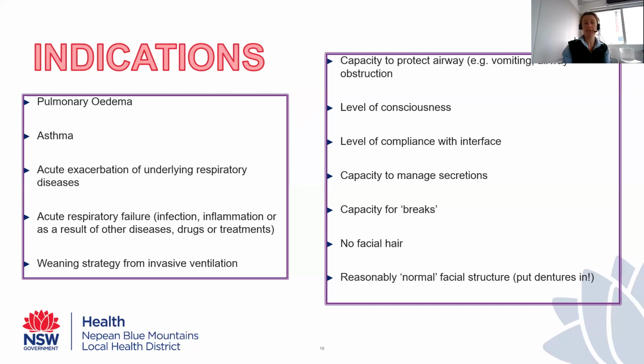It might be every couple of hours they come off for 10 minutes just to have a drink of water. We clean out their mouth. Their skin has a break. We might put a protective dressing on, and then they would go back on. Obviously, when they're coming off for a break, we need to provide an alternate oxygen source, and often that will be high flow nasal prongs, but that's going to be dependent on where you are and your access to equipment. But that's a really important one.